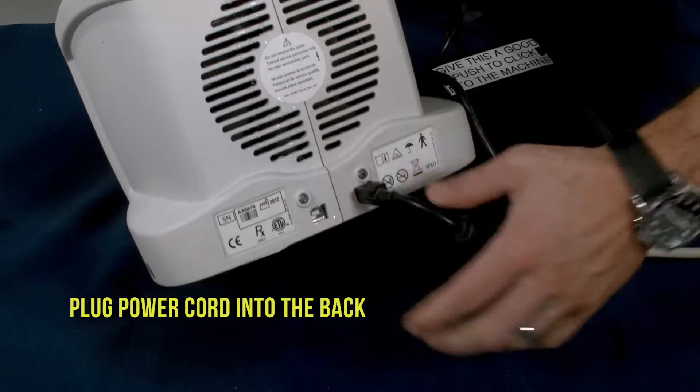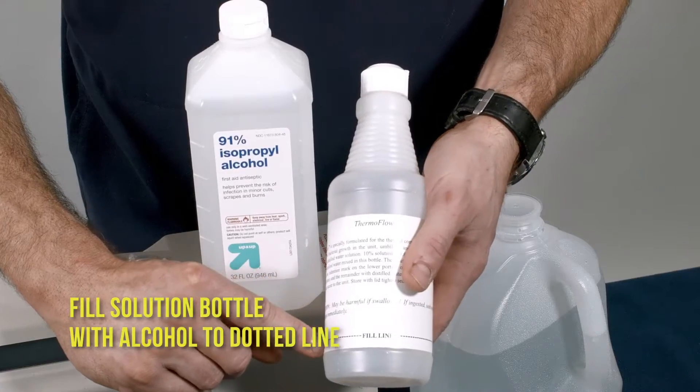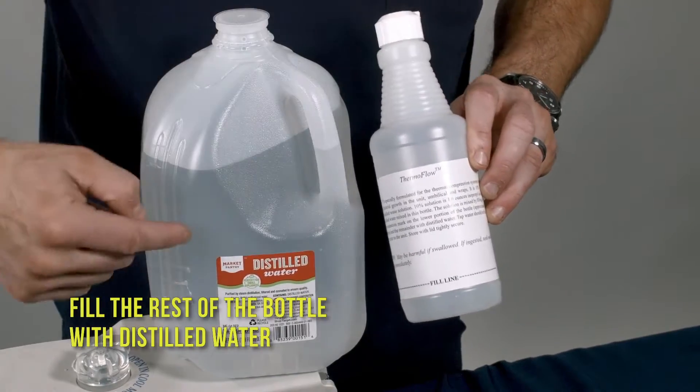Plug the power cord into the back. Fill the solution bottle with alcohol to the dotted line, then fill the rest of the bottle with distilled water.